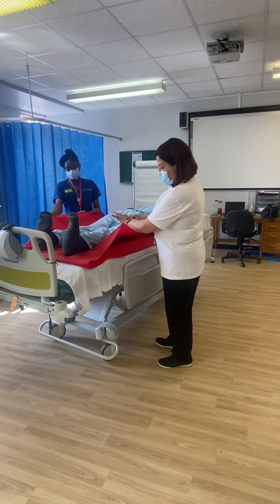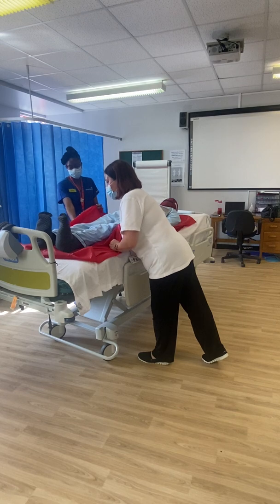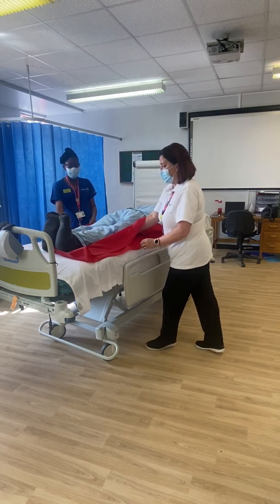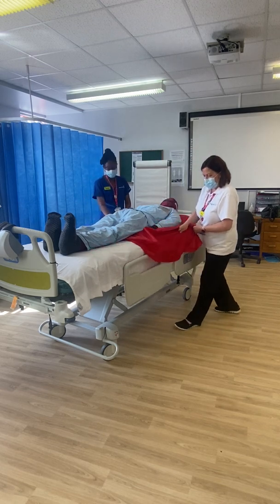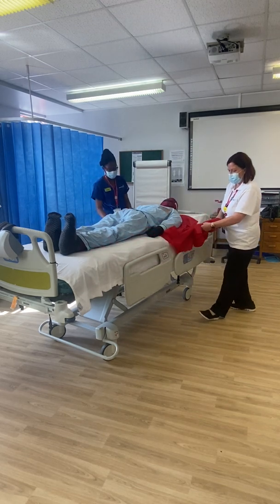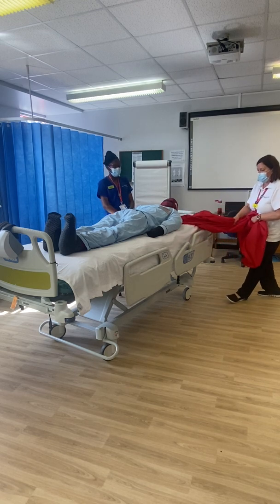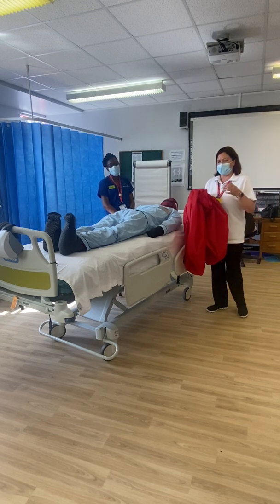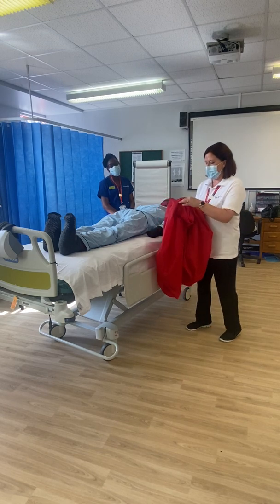So if you lift the slide sheet at one side, put your hand through to the other side and grab the bottom slide sheet, and then in a diagonal upward movement, keep pulling the bottom slide sheet like this. What that does is it brings the slide sheet from under the patient by sliding it against itself.